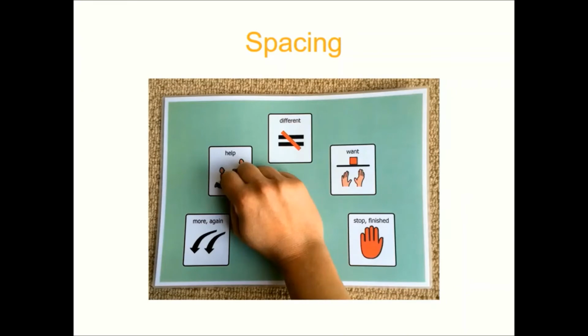Similarly, you can think really outside the box and have this kind of semicircle shape. This can help for people that can't isolate their finger, but they can fist point. So that's another great idea for someone that's not able to use their fingers anymore, but they can actually lift their hand and point with their fist.